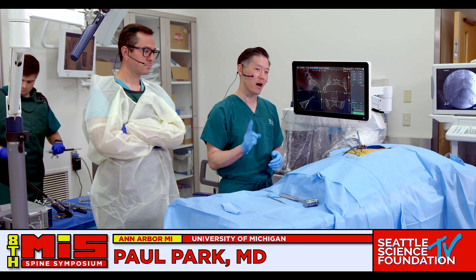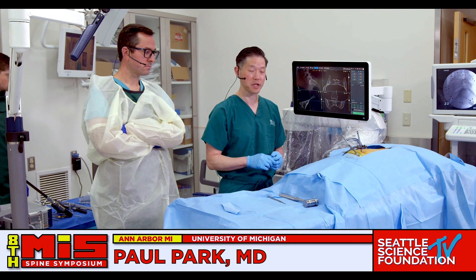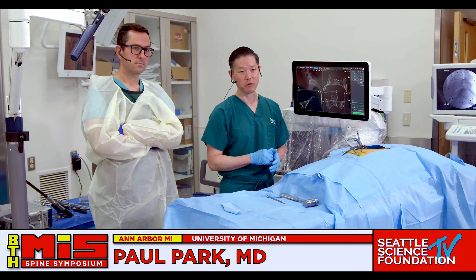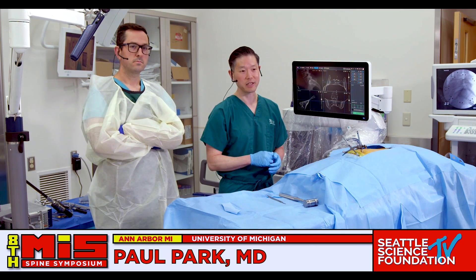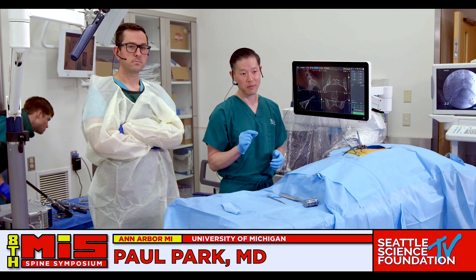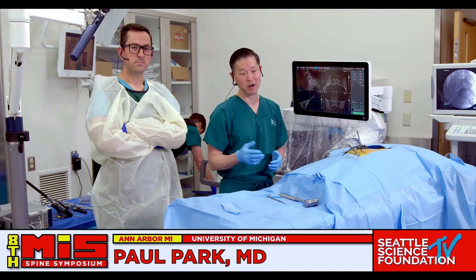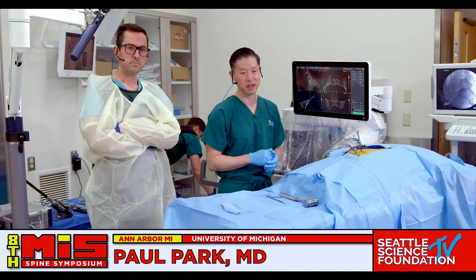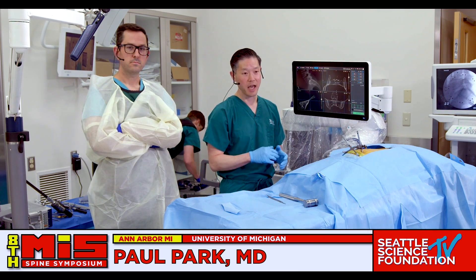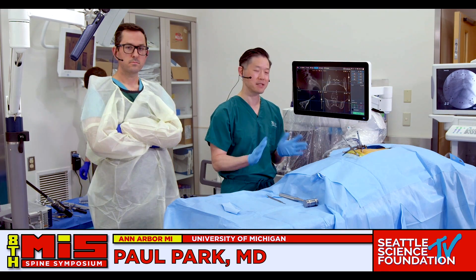I'm going to demonstrate a robotic-assisted MIS sacroiliac joint fusion. I do think there's a certain proportion of patients who have back pain from SI joint dysfunction, and I think a fusion can be helpful. The hardest part is picking the right patient — patient selection is crucial. And if you're going to do an SI joint fusion, utilizing a robot is the best application.